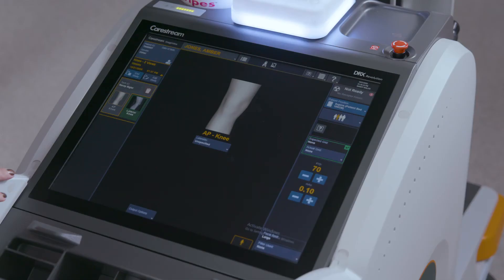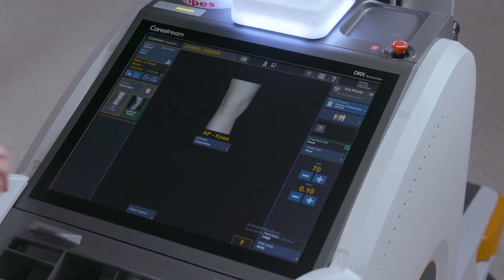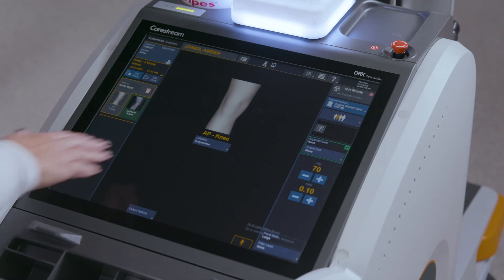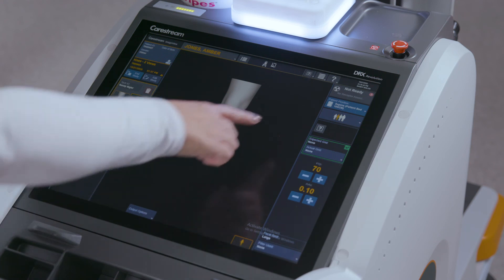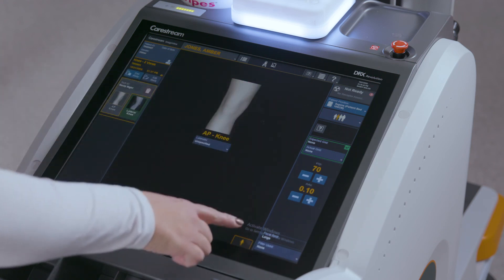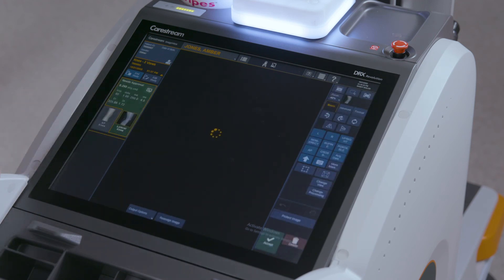ImageView software provides single screen viewing, so your commonly used functions and tools are all on the same screen, reducing the amount of button clicks. The left side stage is where the patient examination information is found for each study. Center stage is the largest area — it is for image review and post-processing. The right stage allows manipulation of exposure factors and access to post-processing tools.